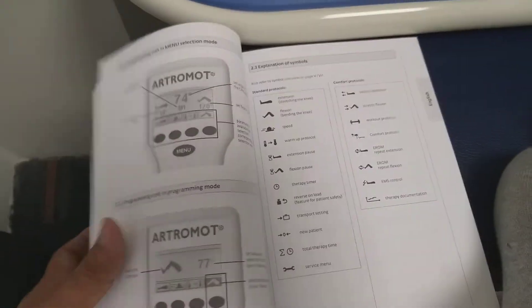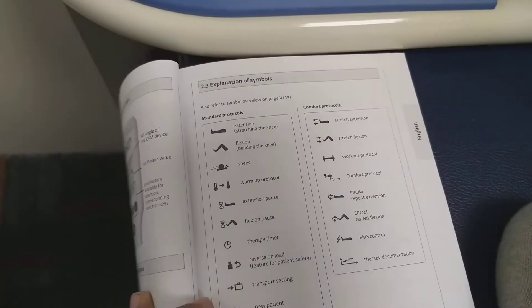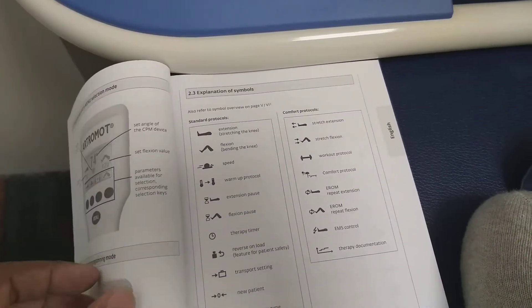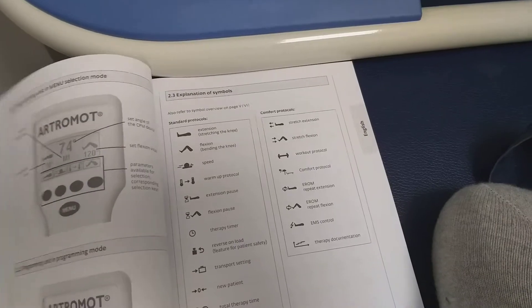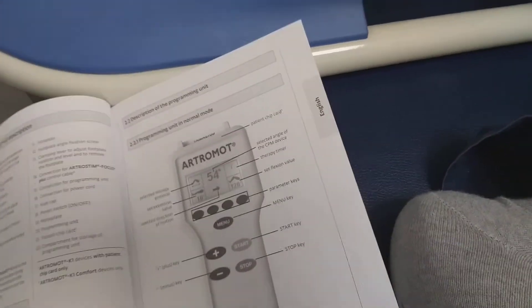You can edit all the parameters. Here you can change the extension, flexion, speed, then there is the warm-up protocol, the extension pause, flexion pause, therapy time, and the reverse load for patient safety.